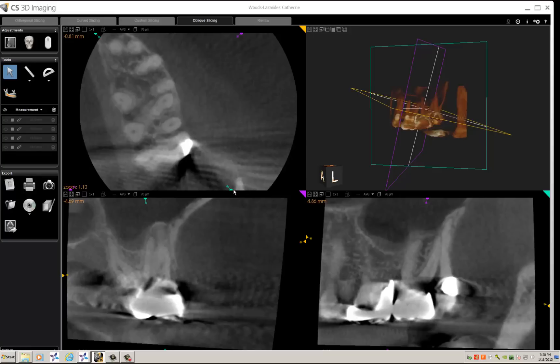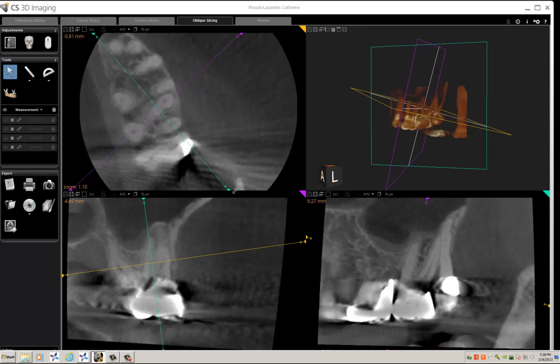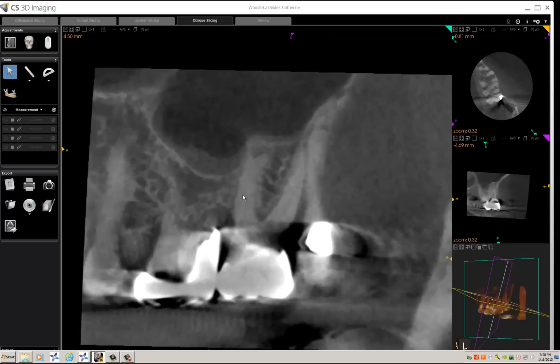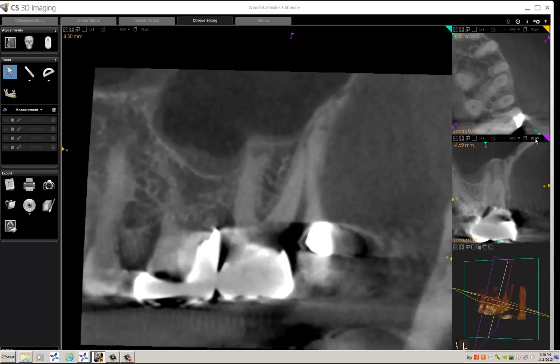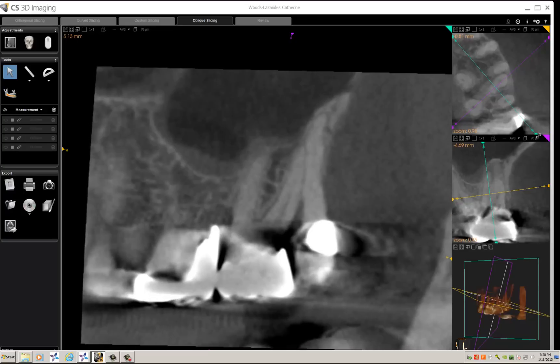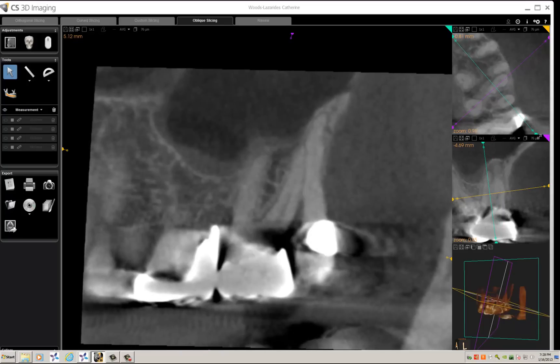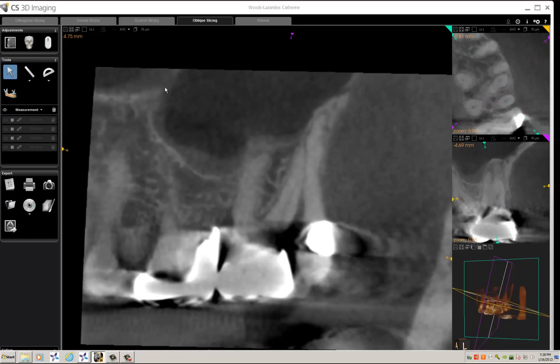By manipulating these sliders, it's very easy to measure each individual root. If you enlarge the sagittal section and slide through, you can see the outlines of both roots — there's the MB1 and there's the MB2 root. If you need to, you can also slide with your mouse scroll bar. That's basically how we measure each separate root independently, and these measurements are very, very accurate.